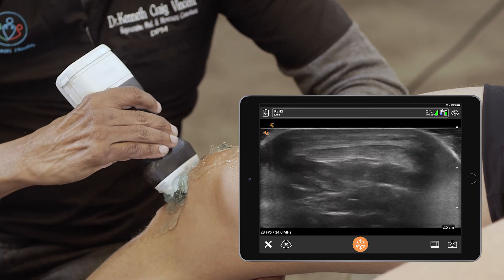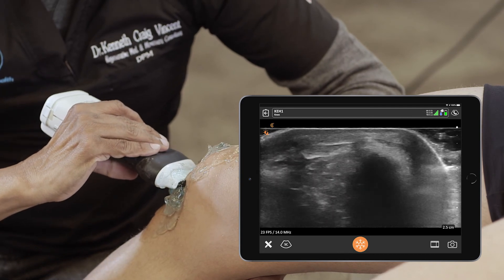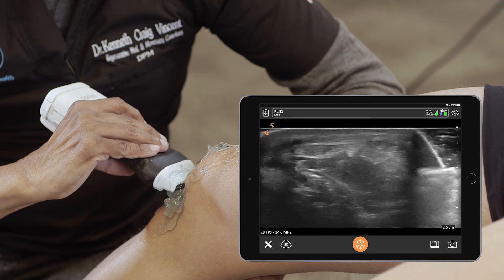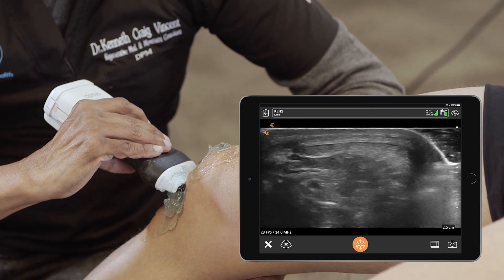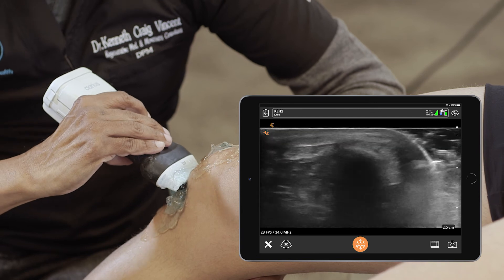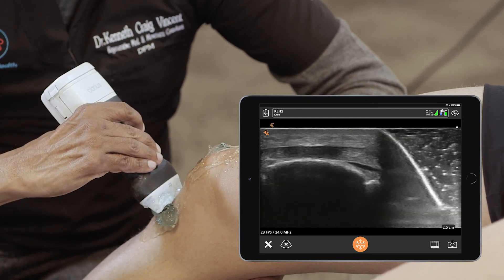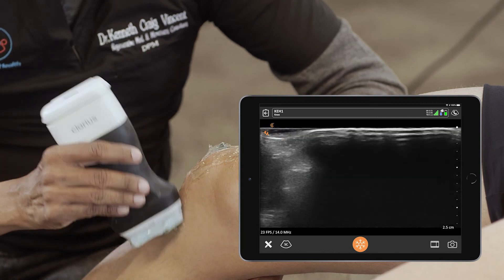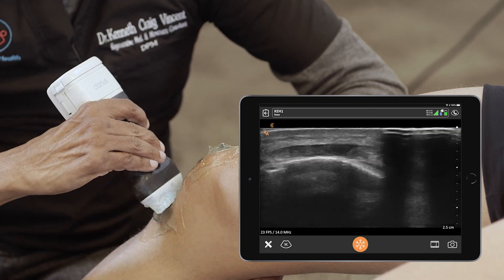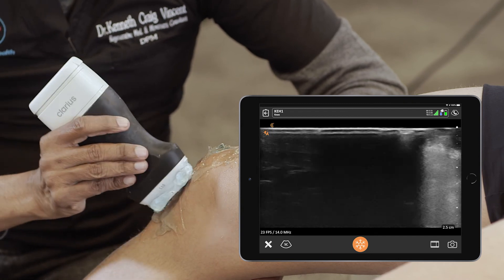I would also recommend a transverse scan going back more superiorly, scanning side to side to make sure the entire structure medially and laterally is covered so that we don't miss any pathology. Then we come down distally towards the end of the insertion of the patellar tendon at the tibia.